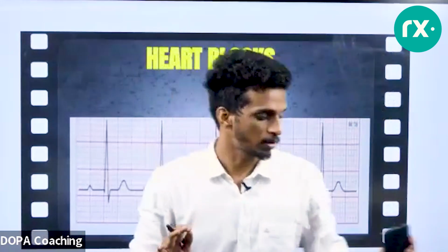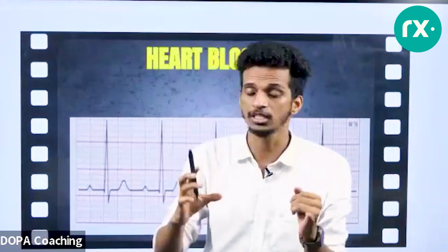But if you are thorough with what I discussed till now, the ultra basics of ECG, we have started with the rate of an ECG, rhythm of ECG. We have discussed tachycardia, bradycardia. We have discussed the squares, what is the duration of each square, what is the normal duration of PR interval, what is the normal duration of a QRS wave.